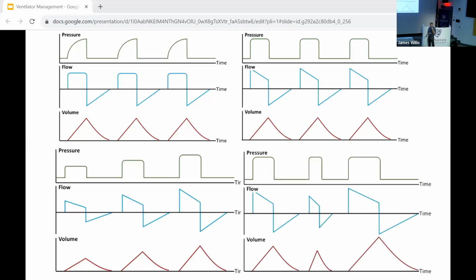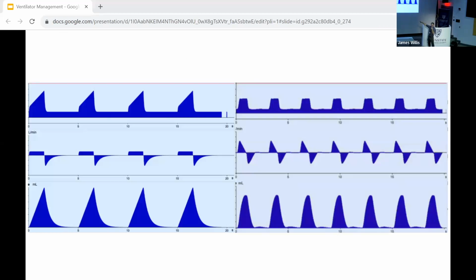And then what's this? Correct, CPAP pressure support, totally spontaneous. What mode is that on the left? Name that mode. Volume, right? It doesn't even say the mode on top, right? You just looked at the screen. That's the point I'm trying to make.